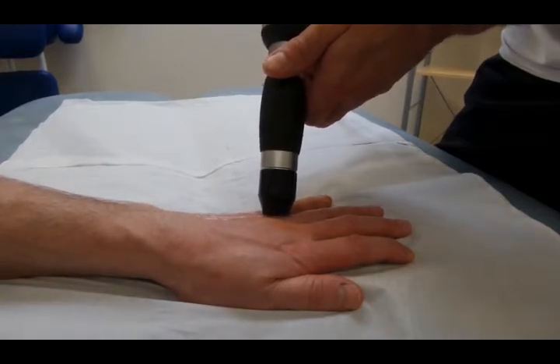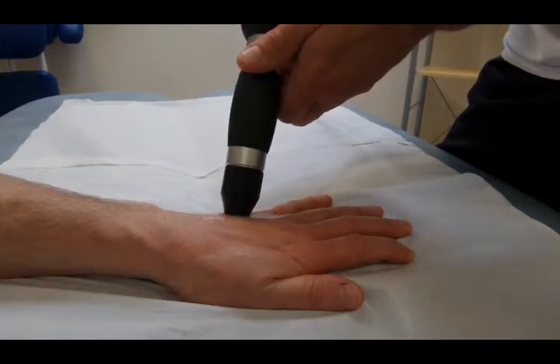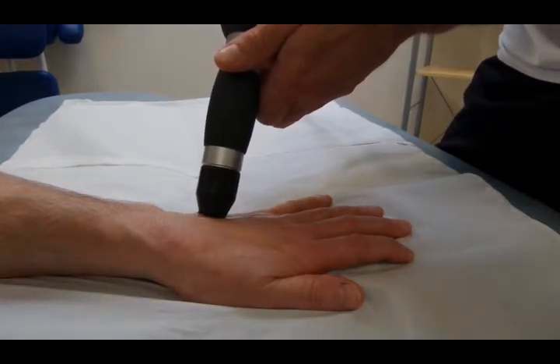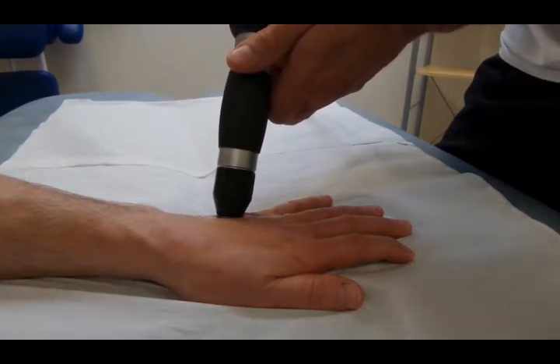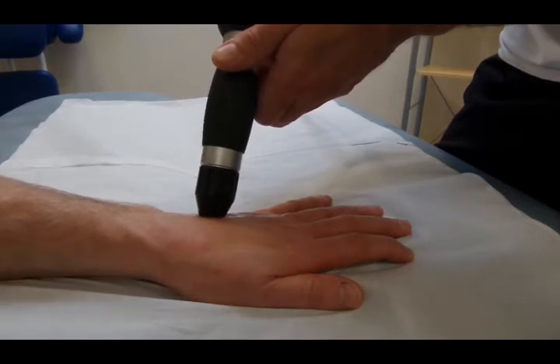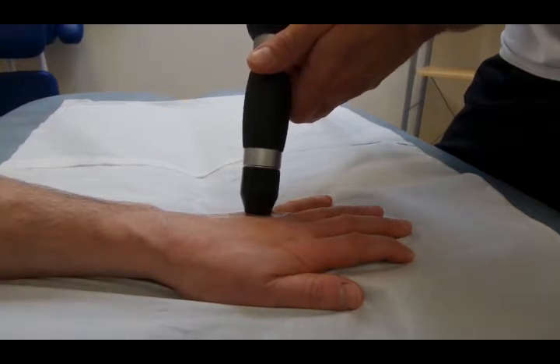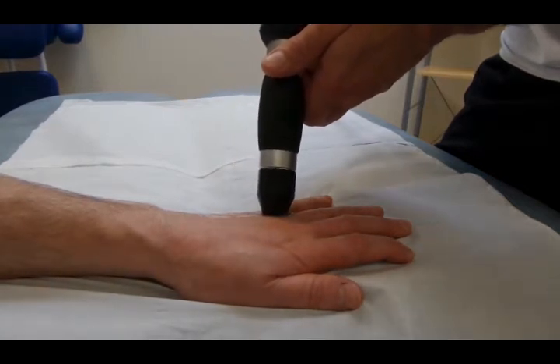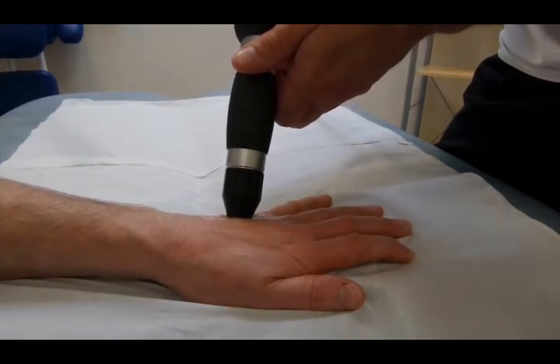Once again you can see us concentrating on the 2 most painful areas. You can see the patient actually moving his arm because of the pain. The whole thing is much less tender than it was originally, when we found it very difficult to tolerate treatment anywhere on the gutter between the 2 metacarpals. We just keep moving here until we finish off the 2,000 shocks.